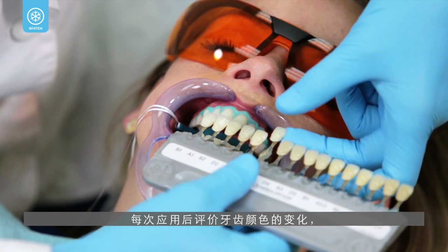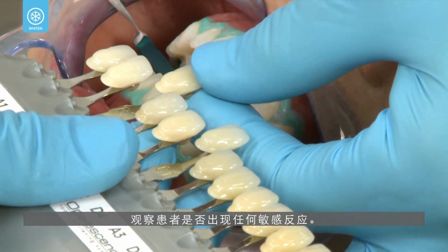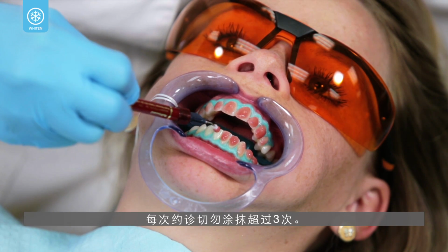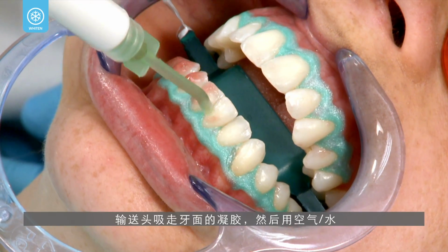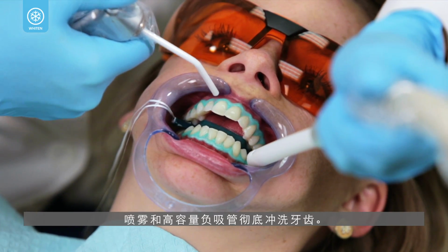Evaluate the shade change after each application and monitor the patient for any sensitivity issues. Repeat application one more time or until the desired results are achieved. Do not exceed 3 applications per visit. Suction the gel from the teeth using the luer vac and surgical suction tip, then thoroughly rinse teeth with an air water spray and the high volume suction.